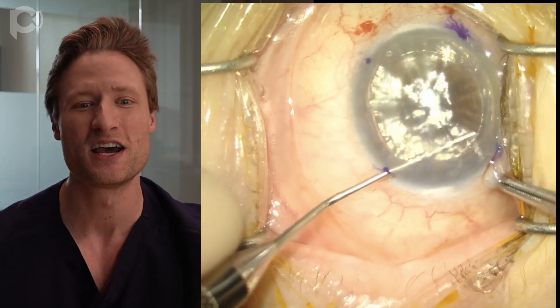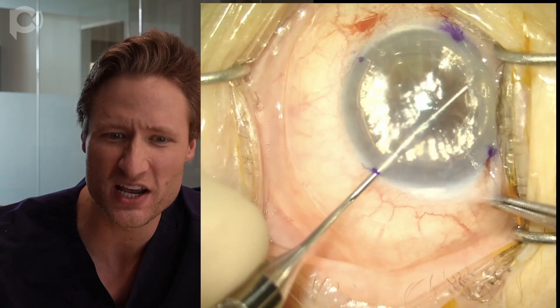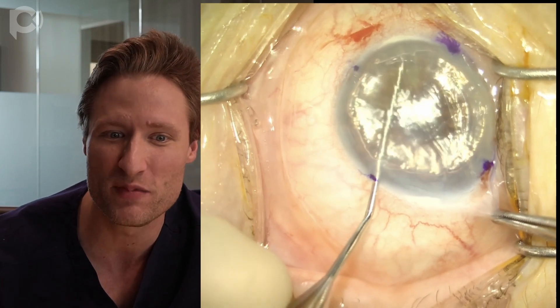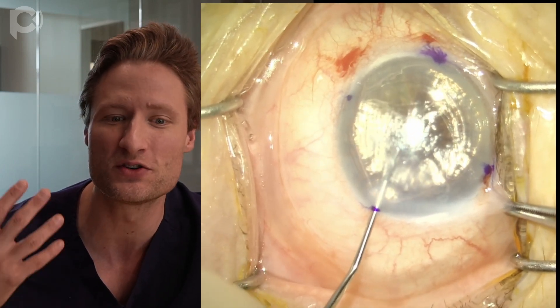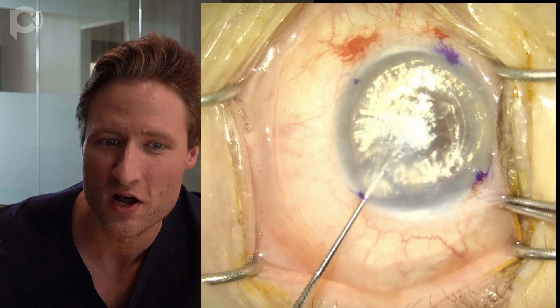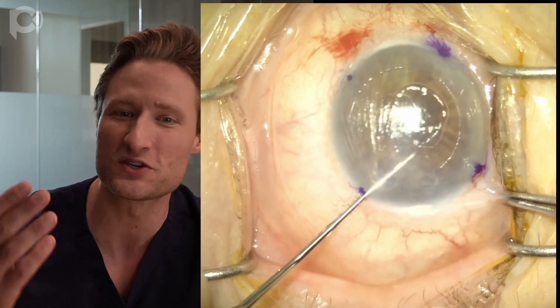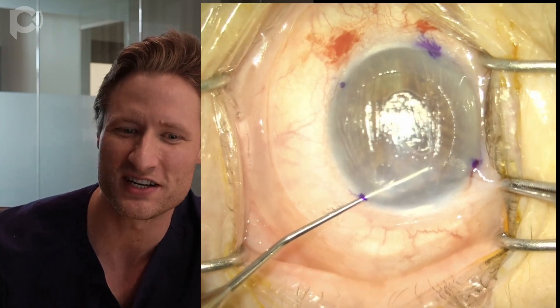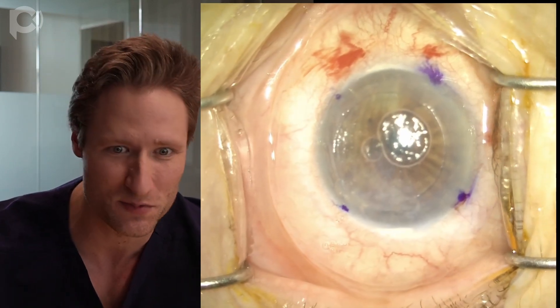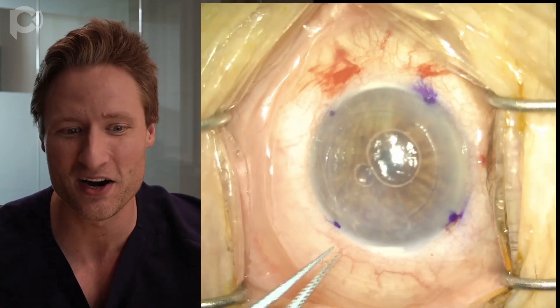That's important with DMEK because if the graft overlaps the edges of the unstripped area, you tend to get detachments in those areas. It's easiest to tell where you've stripped when you do this under air. You also want to use a larger diameter descemetorhexis — with DSAEK you might strip just the central 6-millimeter zone, but with DMEK you want to strip outside the area where you're putting the graft. If you lose the air fill by pulling too hard and distorting the paracentesis, the visibility gets much worse. So you're far more likely to leave remnants behind — which cause detachments — if you don't strip under air.